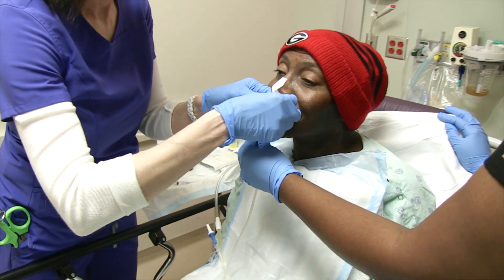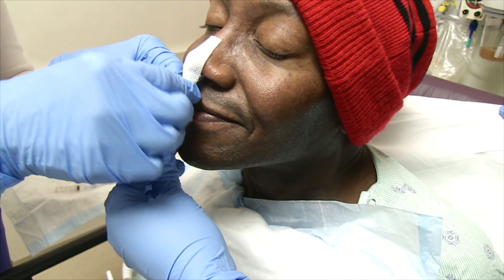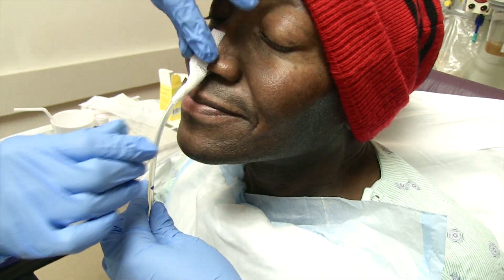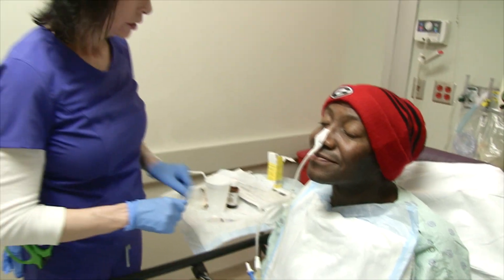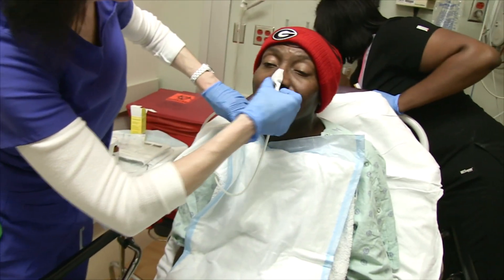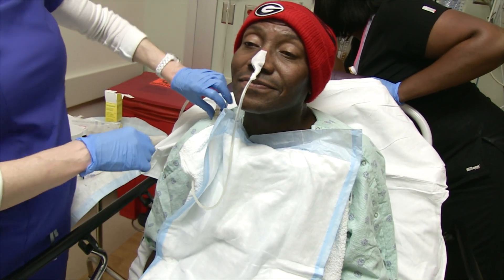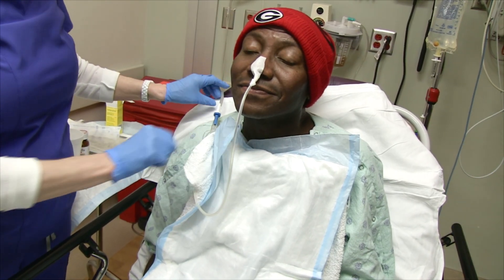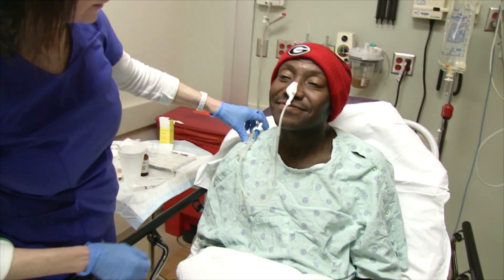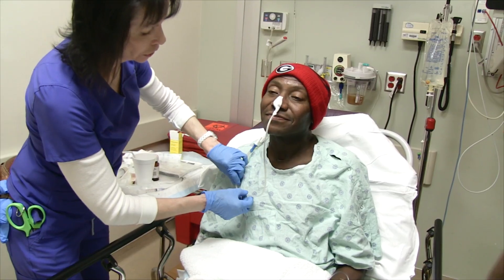Put this where it won't pull. I have the benzoin on the tube. How's that feel? That feels good. So we will get a securing device and put this so it doesn't pull on him, because we really don't want it rubbing against his nasal septum here — this may stay in for days and days, and it will erode the mucosa of the nose. We'll secure this so it won't pull on him.